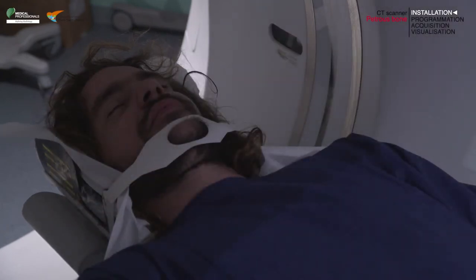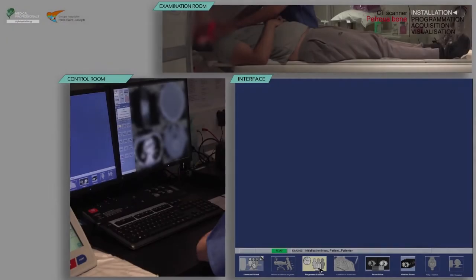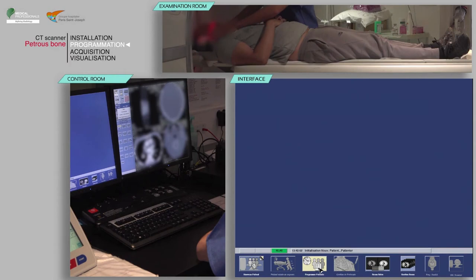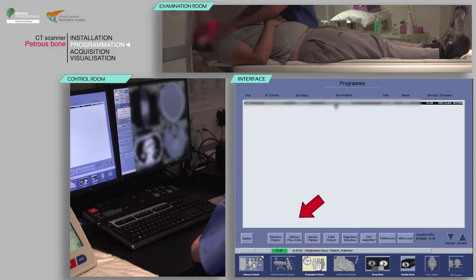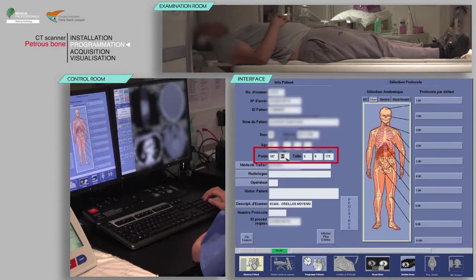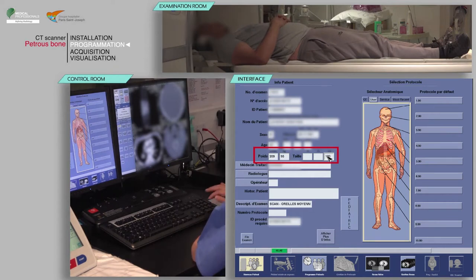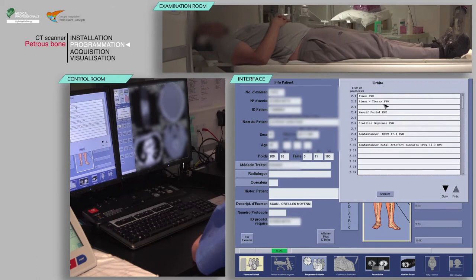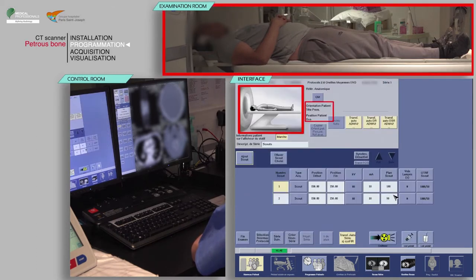Remember to close the doors of the examination room and perform proper hand hygiene. Select your patient from the work list, then click on patient selection. Verify that the pre-filled information is correct and fill in the patient's weight and height. Finally, choose the appropriate protocol.